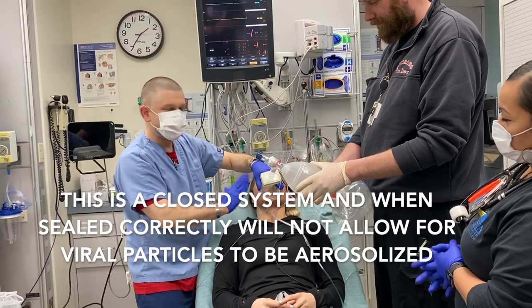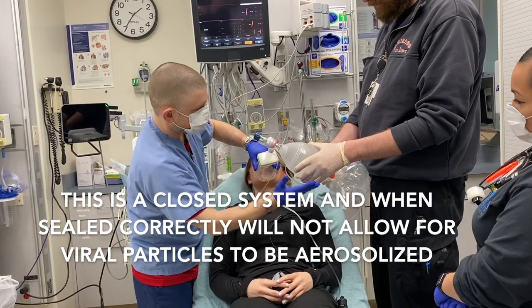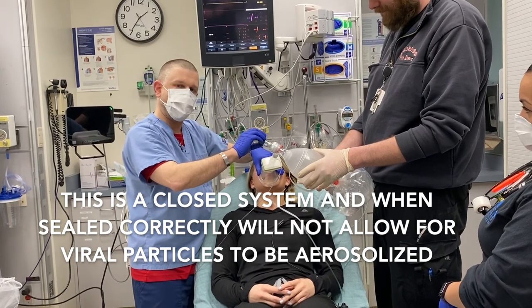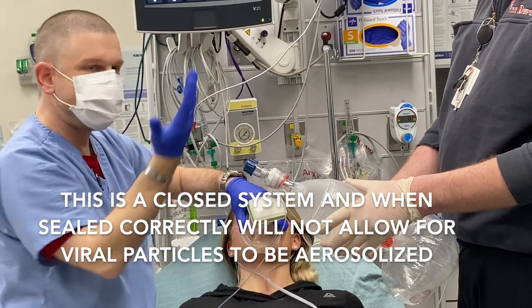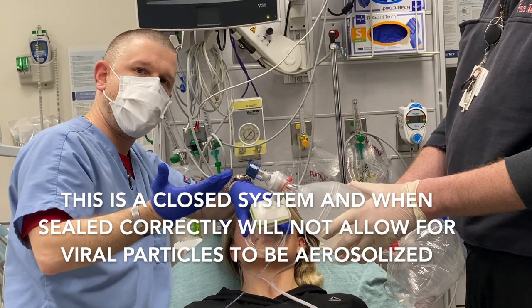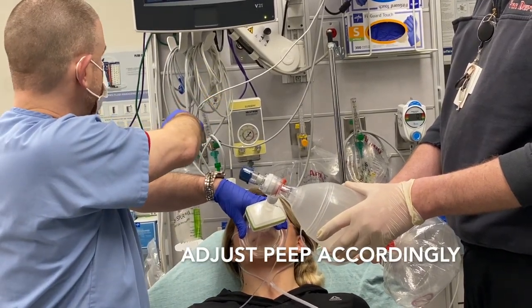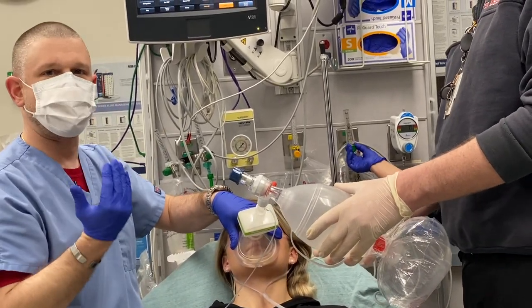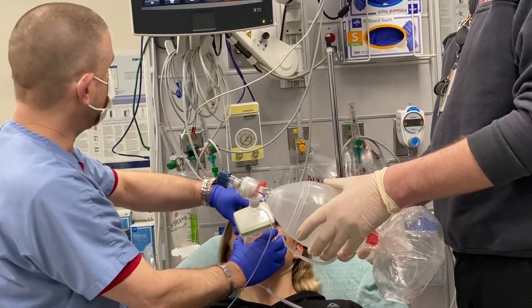As you can see, anything that she exhales is going to go through the viral filter into the system and out the exhalation port here, which is a PEEP valve. So if you need more oxygenation, if the saturations are 89% with this unit, you can dial up your PEEP a little higher to 10, and obviously our nasal cannula oxygen should be on 4 to 6 liters per minute, as we said before, because that's what's really going to activate your PEEP valve. And continue to look at your patient, look at the numbers.